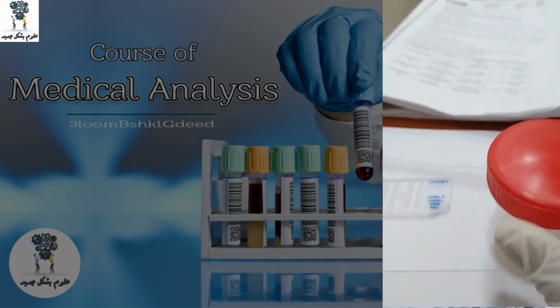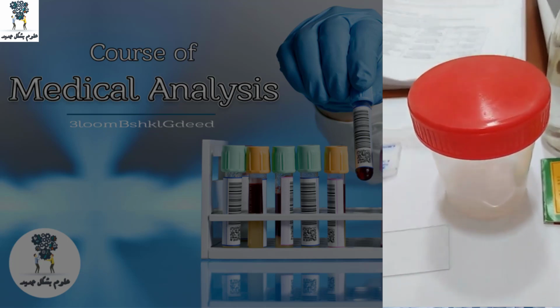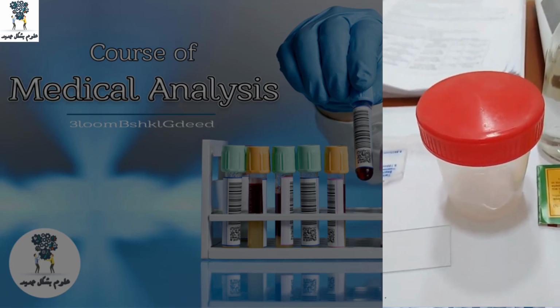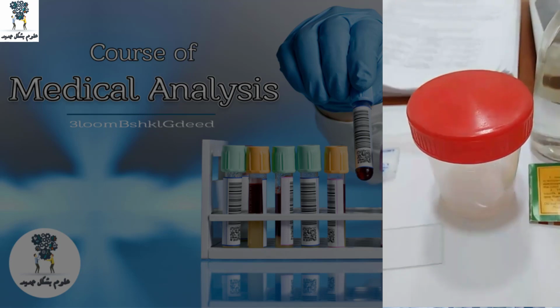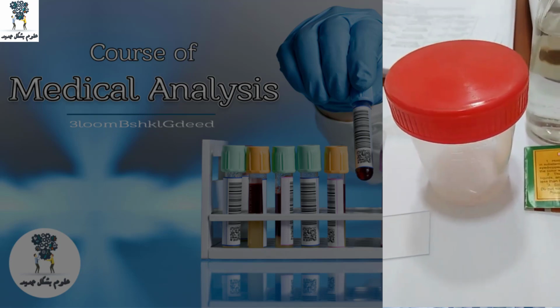At this moment, there will be a precipitate. We will check this precipitate. If there are no sperm, we make sure that really there are no sperm here, so we will write there are no sperm, and we will recommend 3 successive samples.